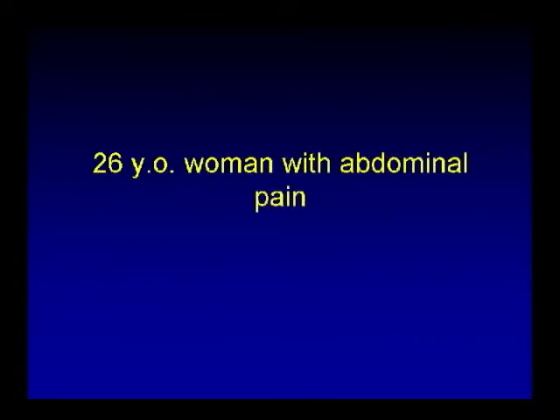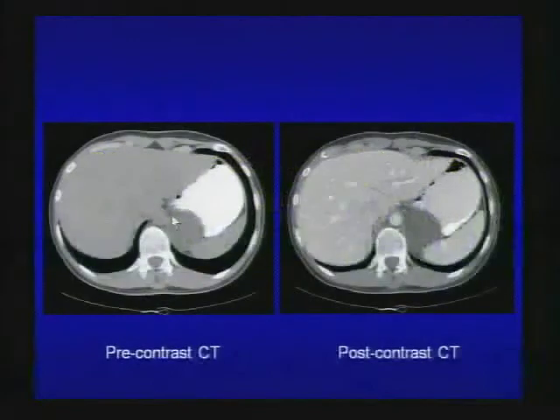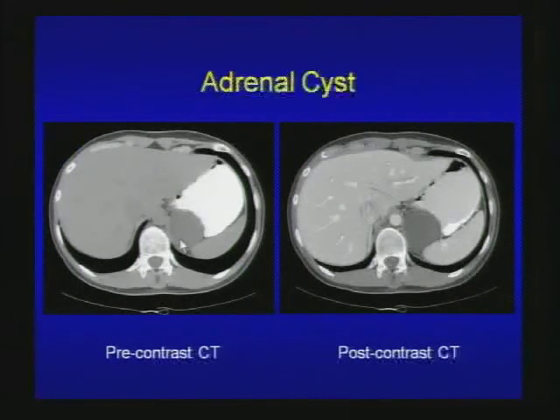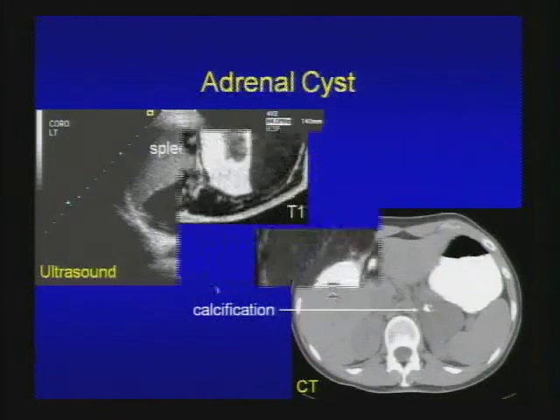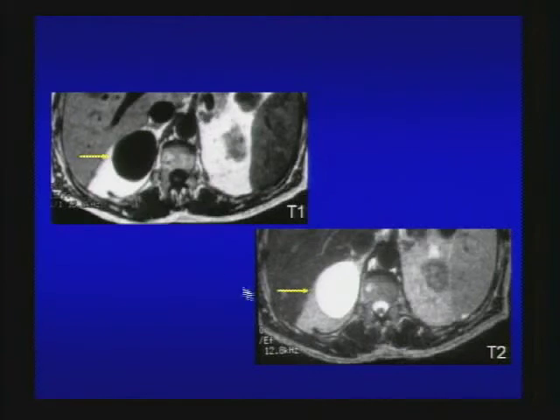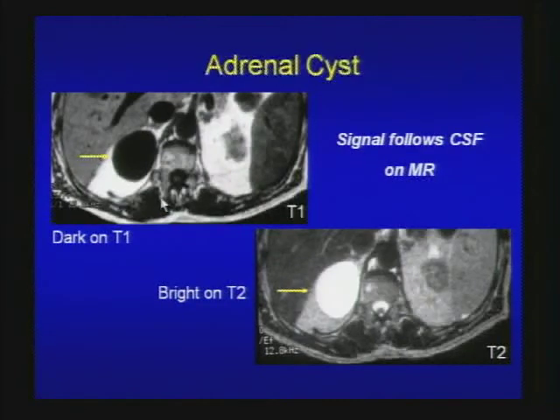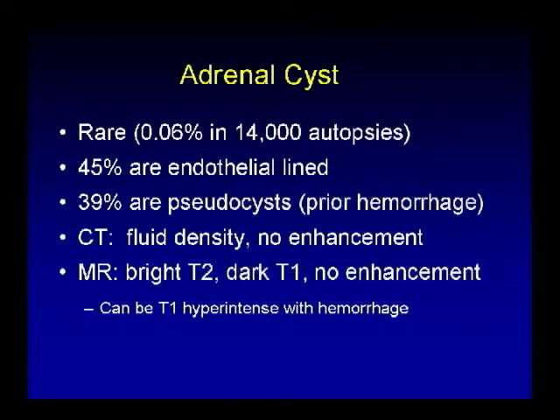Our next case is a 26-year-old woman with abdominal pain. Pre-contrast and post-contrast CT shows a fluid-density left adrenal mass — typical for an adrenal cyst. Another case on ultrasound: cystic adrenal mass with internal echogenicity that looks like calcification, confirmed by CT — another case of adrenal cyst. Adrenal cysts are very rare; 45% are endothelial-lined and 39% are pseudocysts from hemorrhage, and frequently those are the ones with calcification.